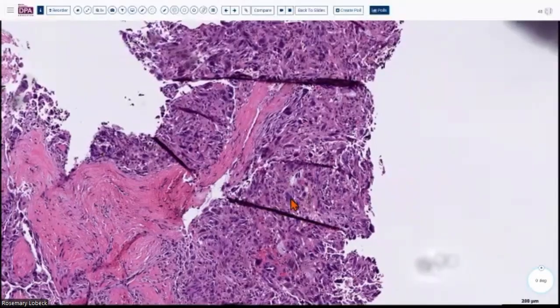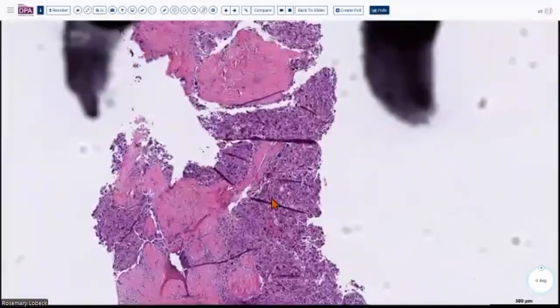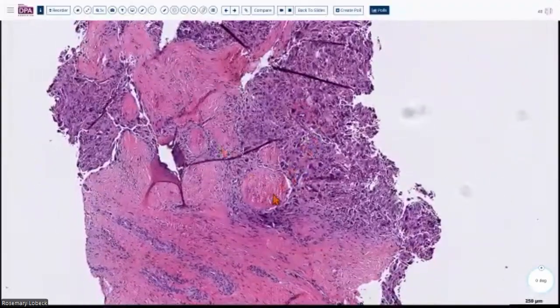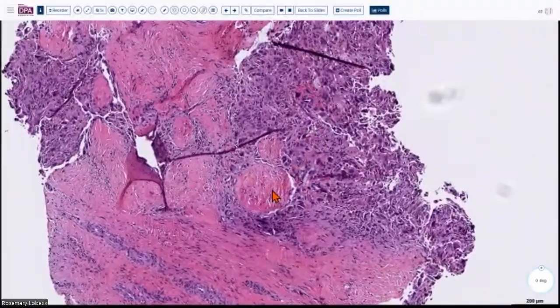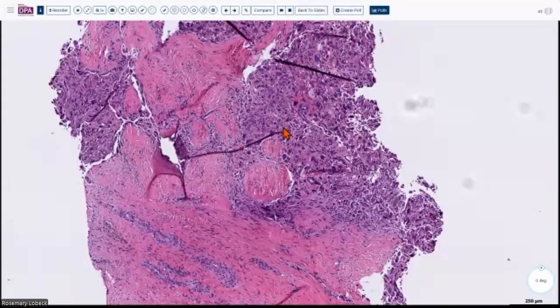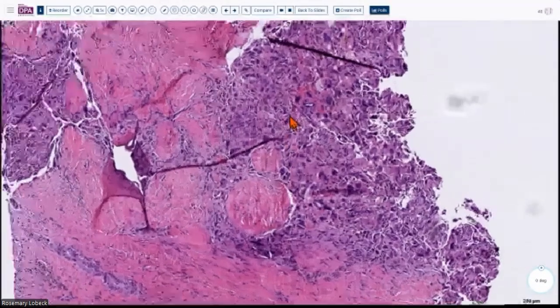It was positive for a histiocytic marker, also for factor 13A. Now, factor 13A is not entirely specific, but in this situation, it gives us a good clue towards the diagnosis. In addition, we see some collagen trapping here as well. So this is a great example of a benign fibrous histiocytoma with so-called monster cells, especially if you put it in the context of a young patient whose lesion enlarged during pregnancy. Perhaps there is some hormonal stimulation as well. So this is a completely benign lesion that is mimicking a high-grade pleomorphic sarcoma.